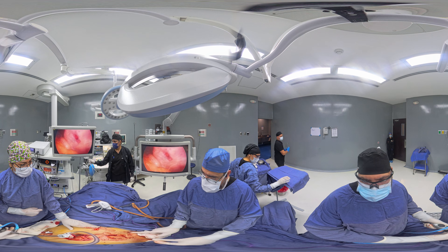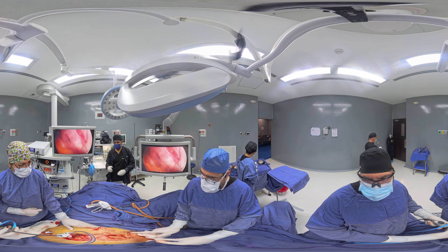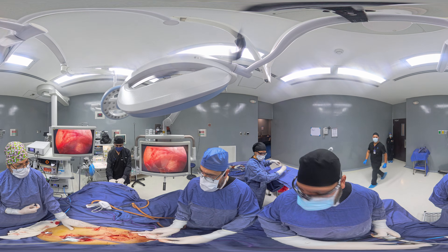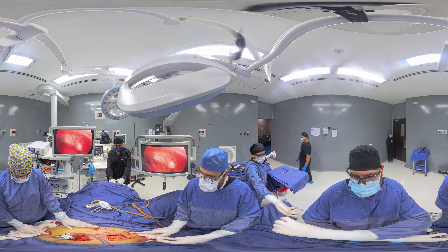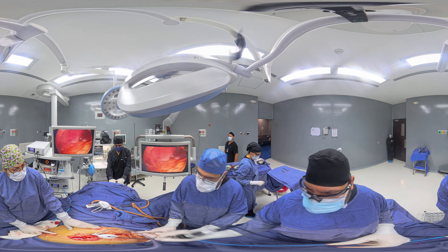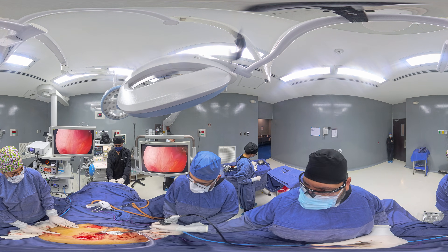Make sure all the trocar sites — the entry ports, the entry areas — are not bleeding. Everything is good. And we are done with this procedure. Thank you so much for joining us.